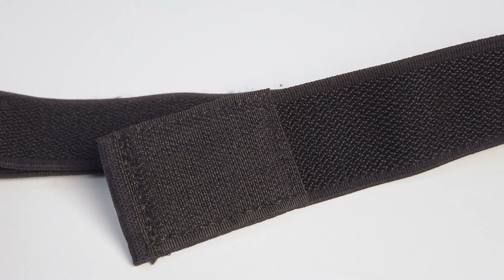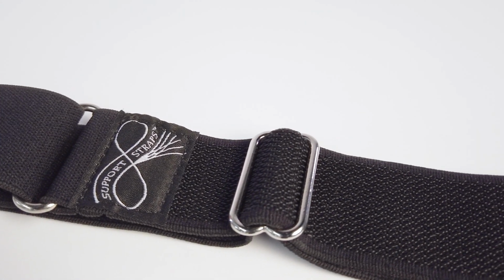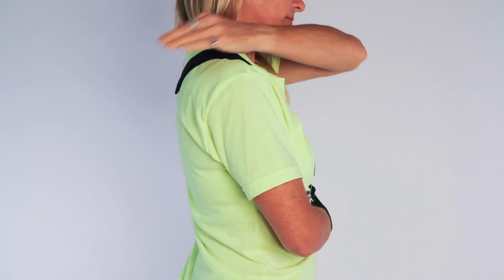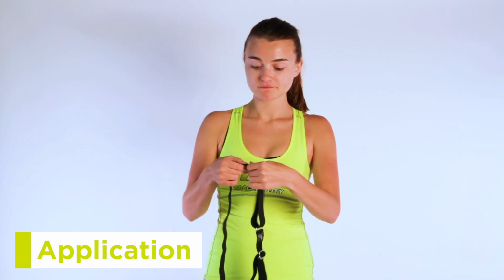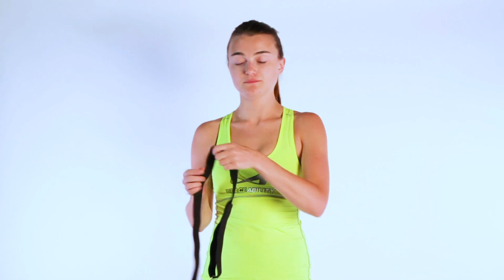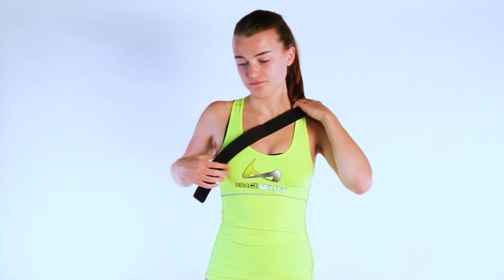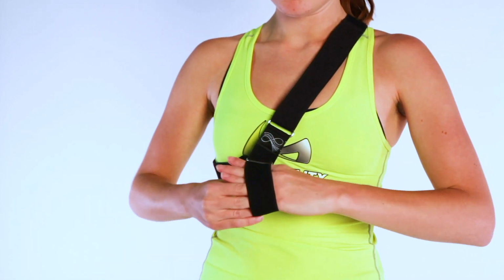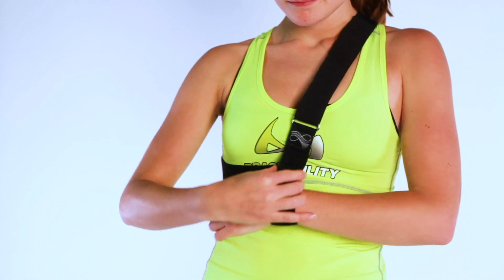The strap uses medical-grade fasteners and a heavy-duty metal buckle, ensuring that it will hold tight throughout the day. The strap system can be quickly adjusted to change the size and fit of both the shoulder strap and the wrist strap. To apply this brace, start by connecting the fastener to close the strap. Bring the strap across your body and over the shoulder that you would like to wear it on, with the wrist strap in front of your body. Place the hand of your affected arm into the wrist loop and tighten it with the metal buckle until it is snug around your wrist.